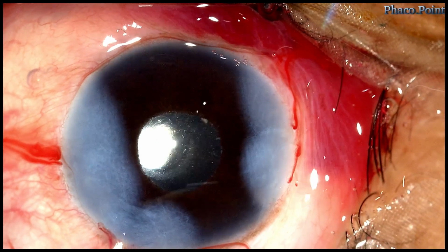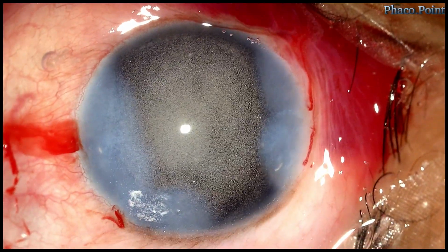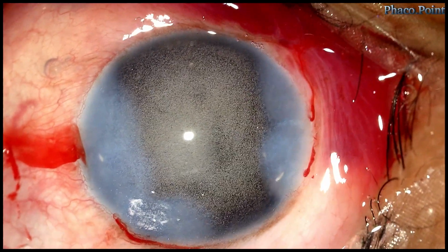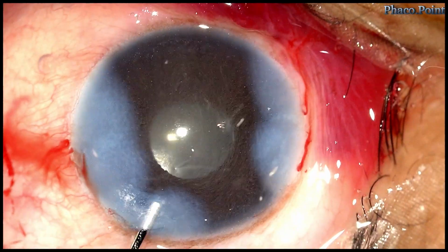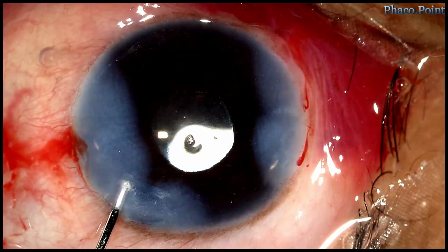In order to ascertain the absence of any vitreous in the anterior chamber, I injected some diluted triamcinolone into the anterior chamber and then washed it out. That confirmed the absence of any disturbed vitreous in the anterior chamber.